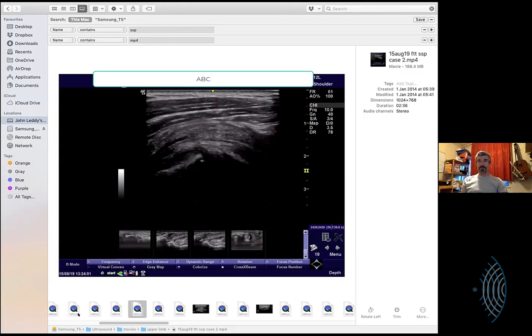I intend to scan my wife's shoulder tonight and go through. I want to be able to see infraspinatus, supraspinatus. I want to be able to see those little areas on the infraspinatus. I want to be able to see anterior, posterior supraspinatus. I want to try to at least look for the cable. And that's very valuable. Well, if you don't manage all those things with your wife, then next time, come in and scan her with me and link it up. I would love that. Let's just plan on that.